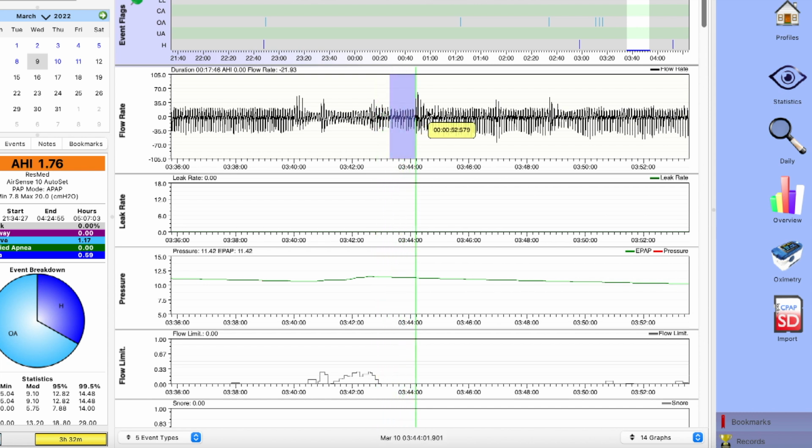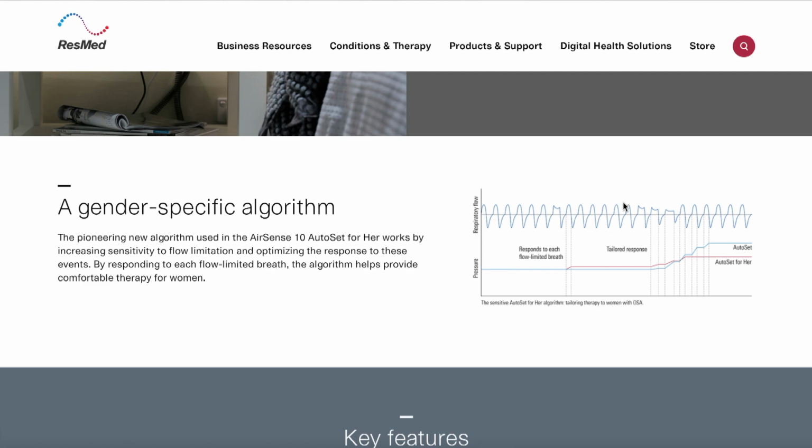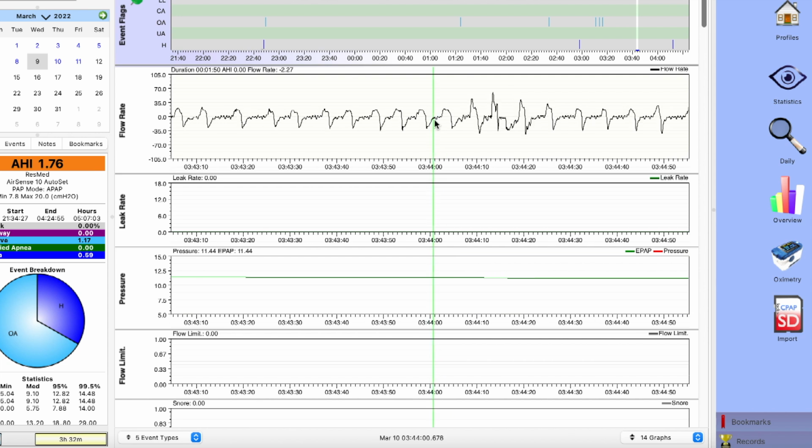If we go in even tighter, look at this. You can see the flattening on the tops of these waves. They're not big and puffy and full like we want to see over here. Look, they're not full. They're flat. But yet these are flat also and nothing's happening. It's not increasing the pressure.